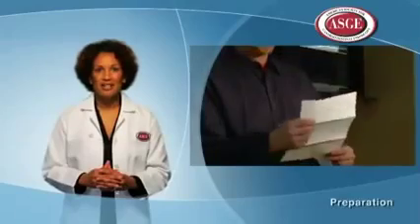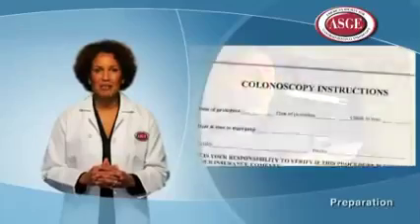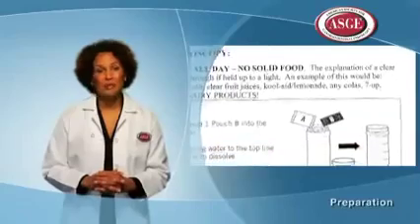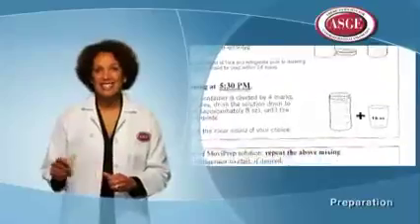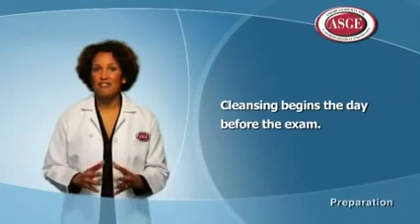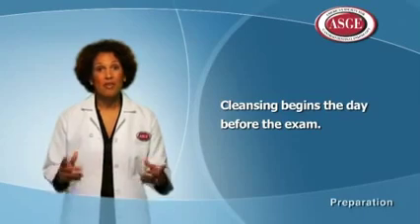Before having a colonoscopy, you'll receive instructions on what to do leading up to the colonoscopy well in advance of the procedure. These instructions will focus on what you may or may not eat, what to do with medications you're currently taking, and how to drink the bowel prep. You'll be advised of the diet and the cleansing routine to follow before the procedure. Cleansing with the bowel prep begins the day before the exam.